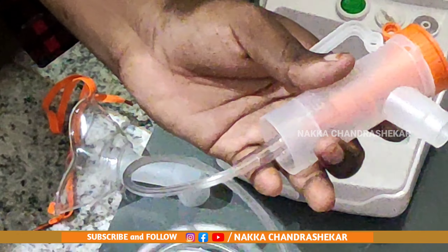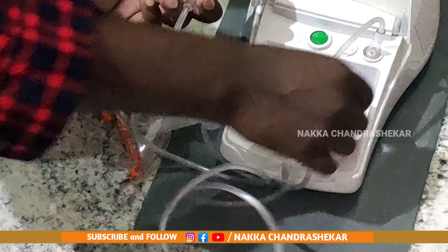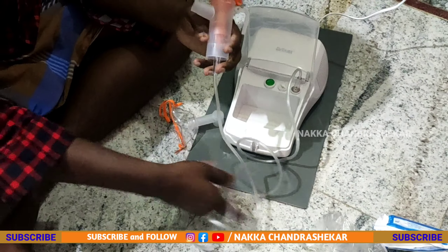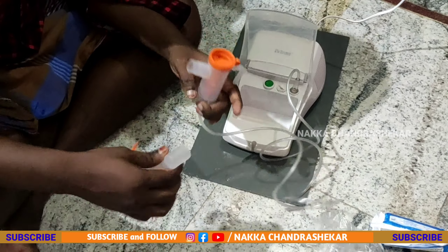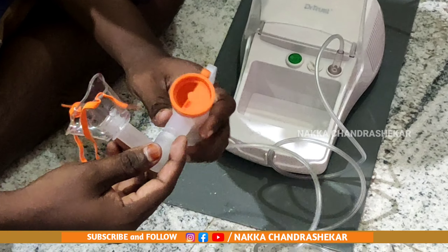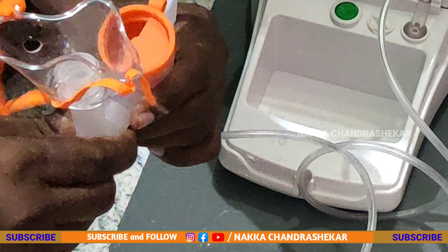I'll start the nebulization machine here. I'll start the airflow. I'll build the air from the front here. Let's have a look at the front of the camera — let's see how this camera is going to take the view.